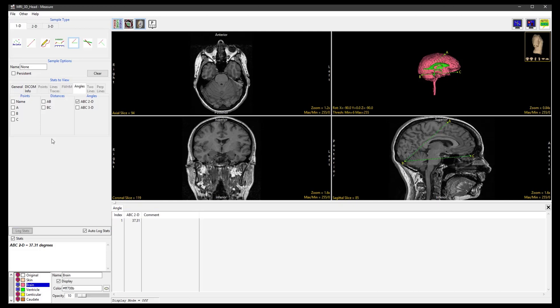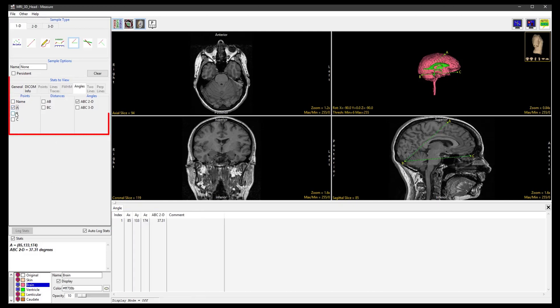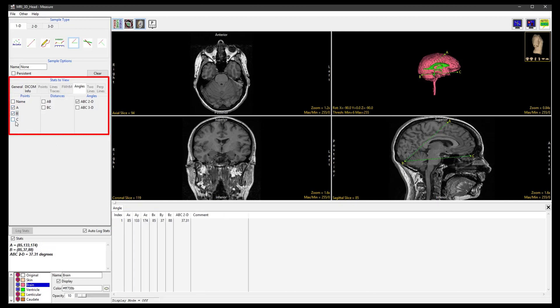We can click any of the Angle Stats to View checkboxes and the measurements will be displayed in the Stats Review area and the Stats Log.